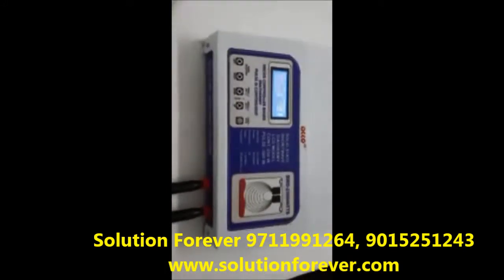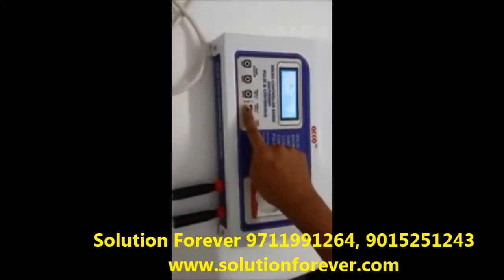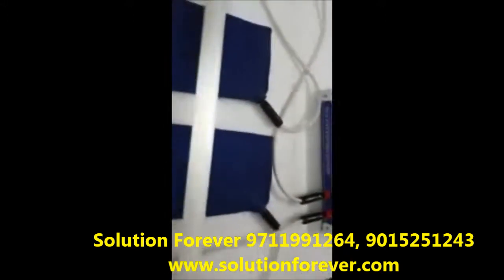After setting all the parameters, start the machine. Now increase the intensity as per your need — intensity up, intensity down.